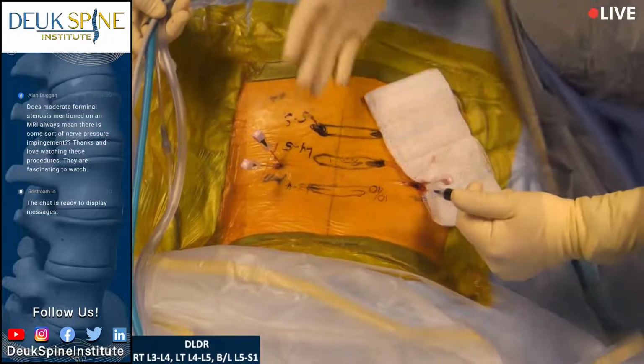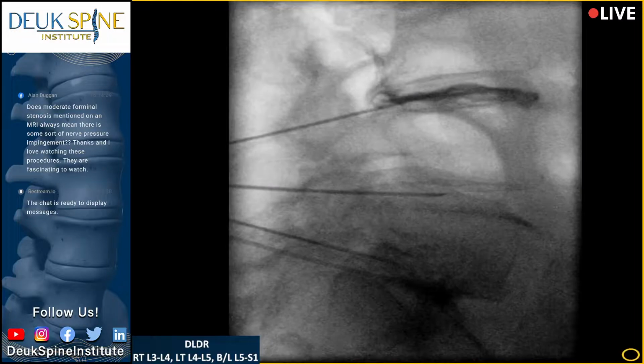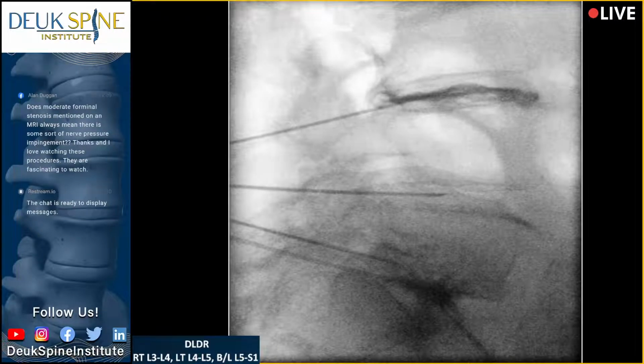Did you see her lurch her body up and you heard her, right? That was 5-1. Yes. Okay. How bad was that on a scale of 1 to 10? 10? Yeah, she's smacking the cushions on the bed. So basically we tested the bottom disc. You can see that dark material. It's still over dark. It needs to be a little bit better exposed. So the L5-S1 we tested through the left side, and it's a 10 over 10.